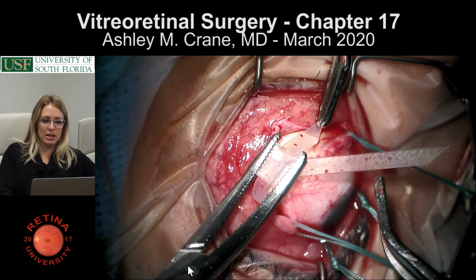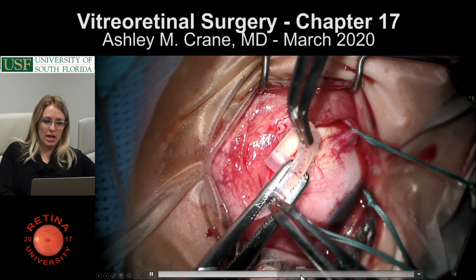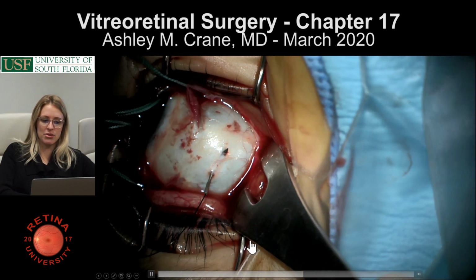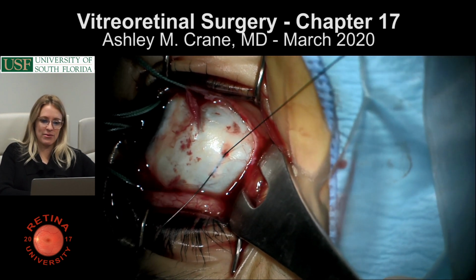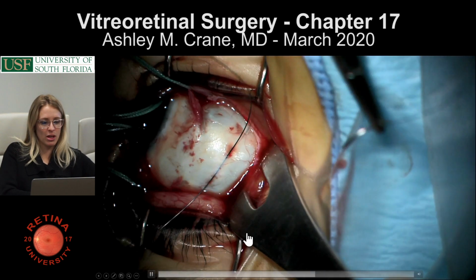So you can make a little mattress suture, and the suturing is really necessary. You really can't do the tunnels if you're using different types of elements, like not an encircling buckle. You have to do it with sutures, which is a very good way to do it too.